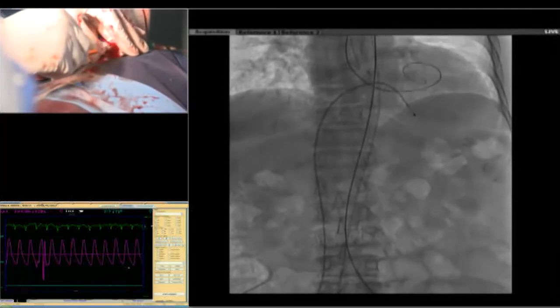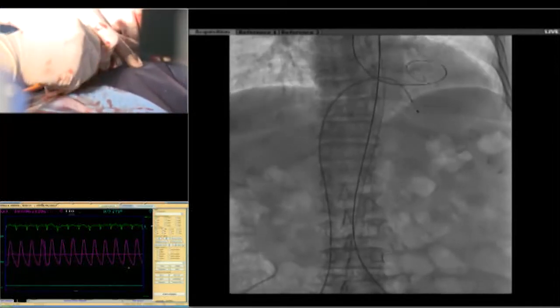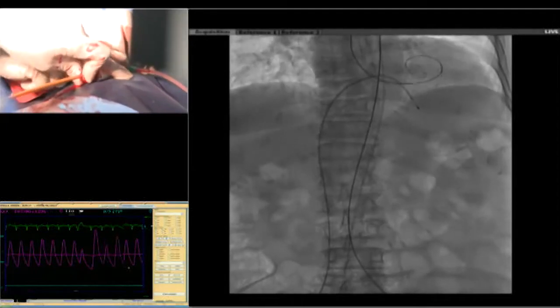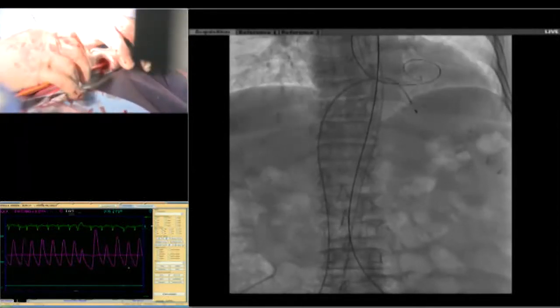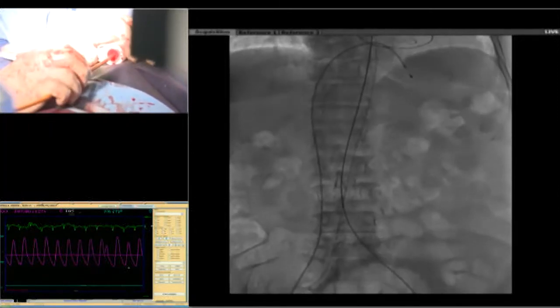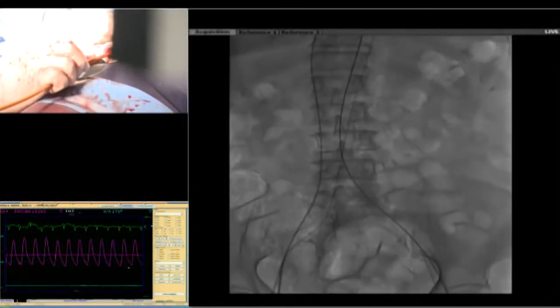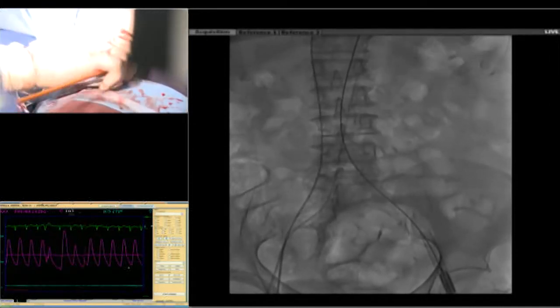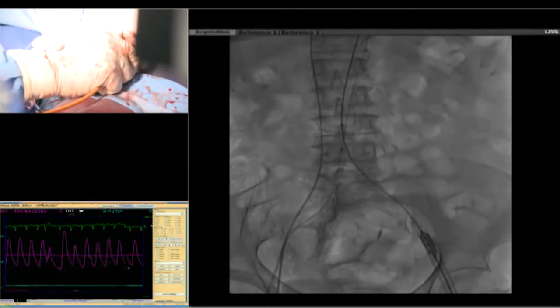That's it. Okay. Lock it a little. But now you try to go in. That's good. So don't even lock it. Just go. Okay, let me see it now. Down. Show us down. Okay, can you push it? I'm going to push it, yeah. I'm going. You can unlock it again if, no, it's going. That's good. Okay. Now show us the wire there.